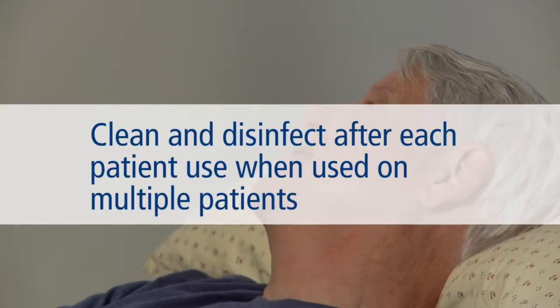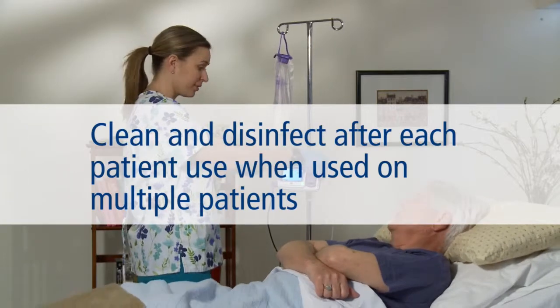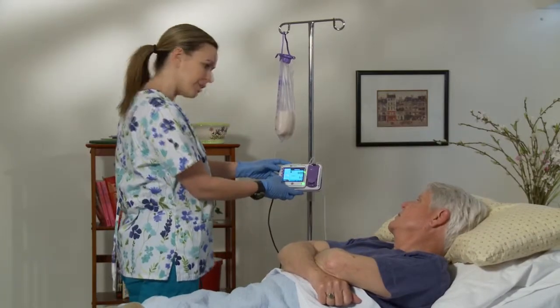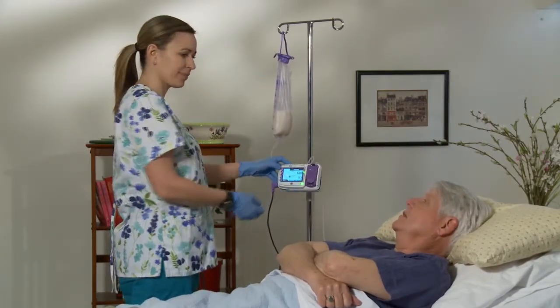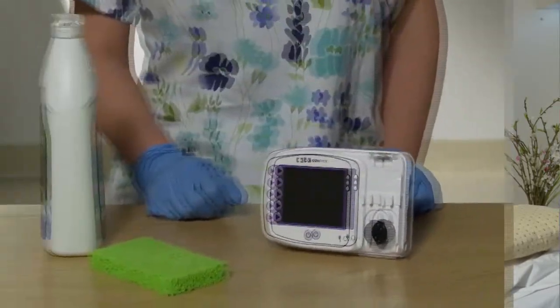Always clean and/or disinfect the pump after each use when these devices are used for multiple patients. This is to prevent spreading bacteria, viruses, and other germs between patients that interact with the same pump.